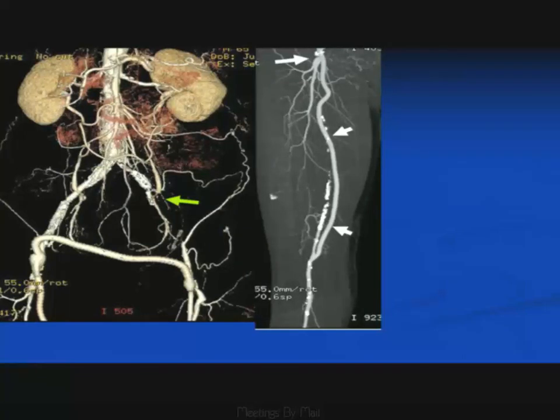So here's a patient who's obviously got iliac disease and has had a right to left femorofemoral prosthetic graft. And I think we displayed that pretty well. We've also got collateral circulation. We can demonstrate epigastric and circumflex iliac on the left side. On the right side, this patient's also got a femoropopliteal above knee prosthetic graft, and everything looks good.